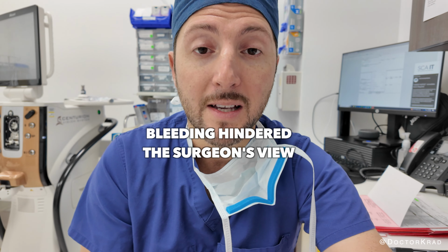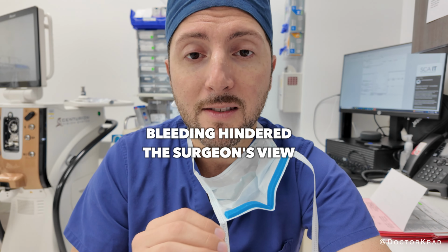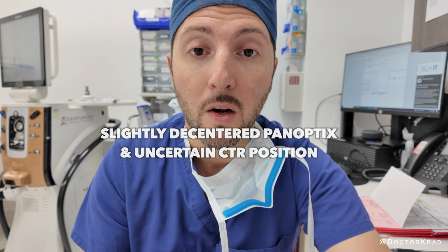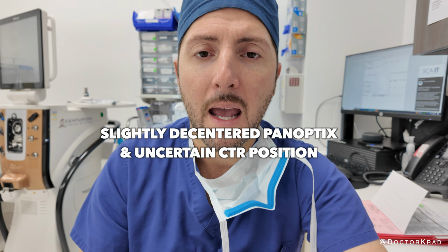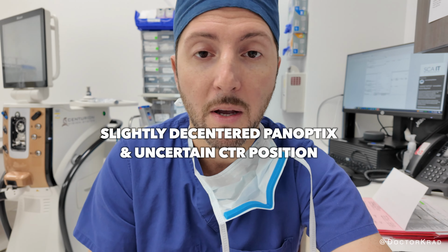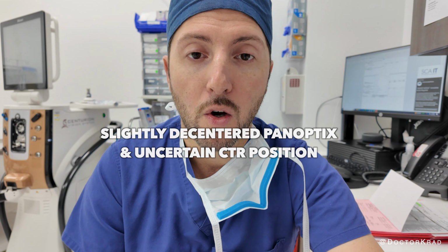And so now the patient has had two surgeries. They had some bleeding in the eye, so they weren't seeing anything. And the doctor was concerned that the CTR was not in the correct place. And afterwards, the lens wasn't centered perfectly either, and the patient had poor quality vision. So the patient was referred to me.